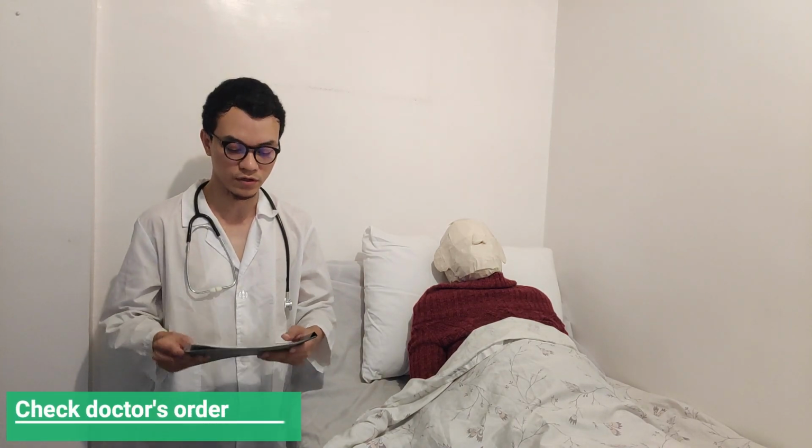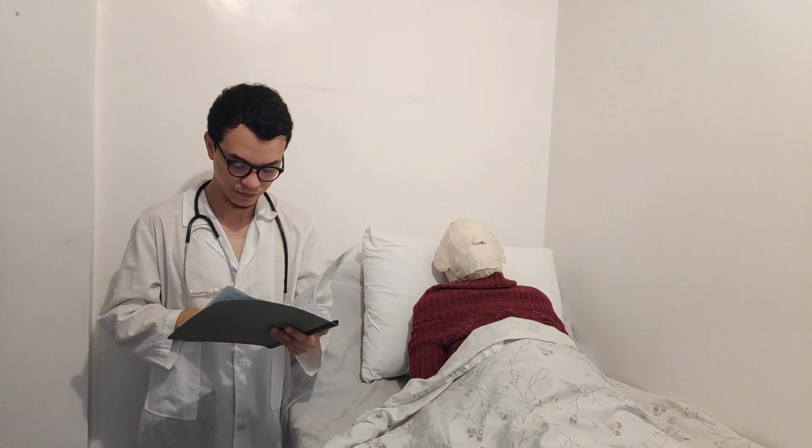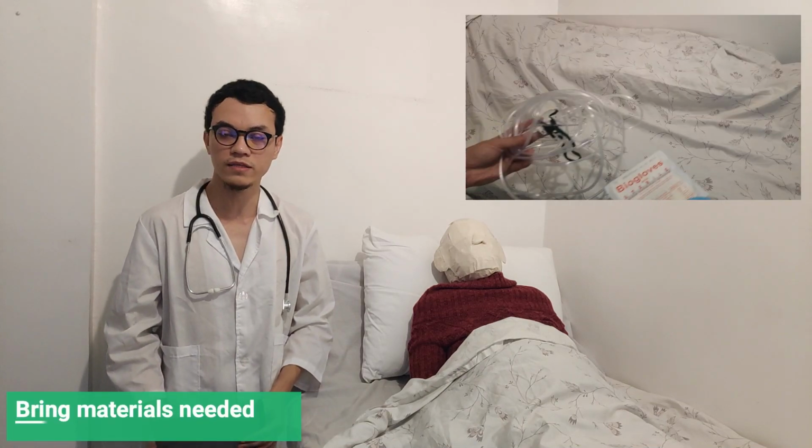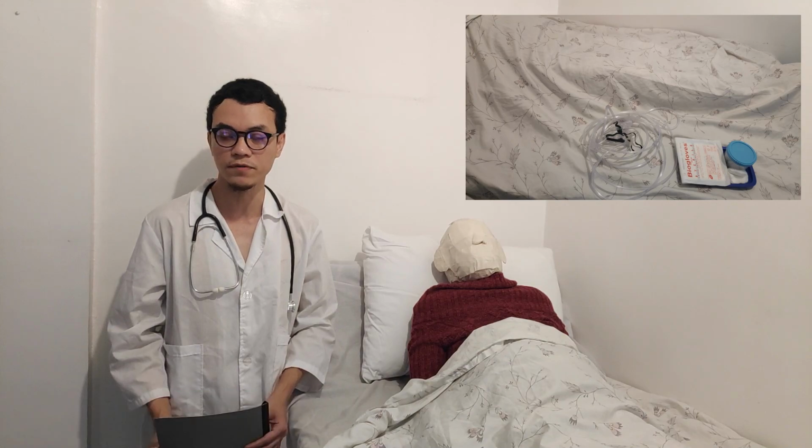Hi everyone, today I am going to demonstrate how to administer oxygen by nasal cannula. So the first step is to check the doctor's order. Next is bring all necessary materials needed on the bedside stand or overhead table.